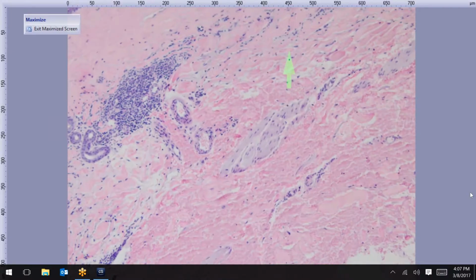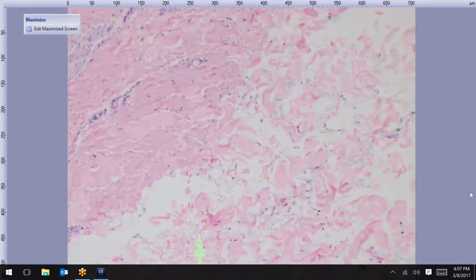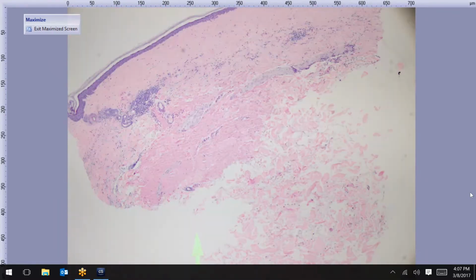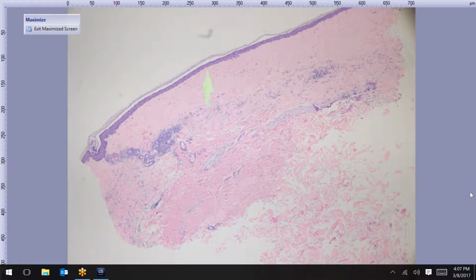Right here you should have, for the most part, normal collagen. Somewhere in the collection, I don't know if we'll see it today, but you can also have overlap of LSA and Morphea. So you'll see this kind of pathology here with some lymphocytes here, and then it'll look like Morphea underneath, and that's been well reported.